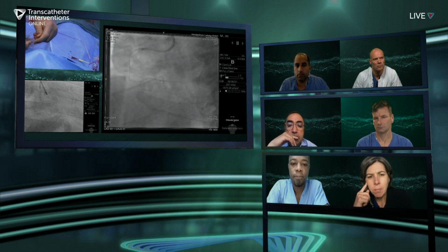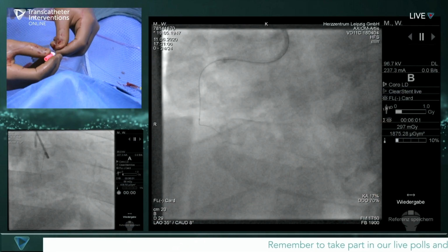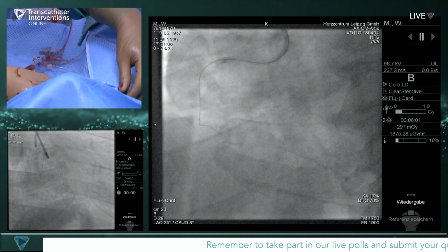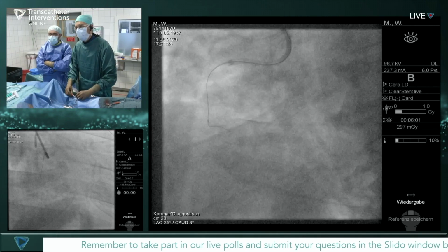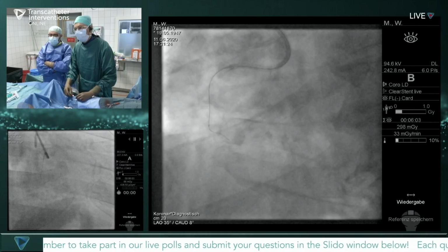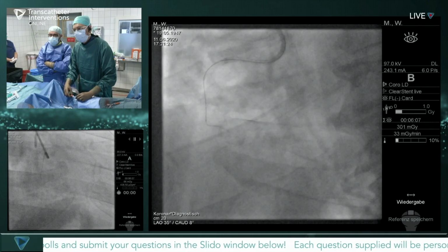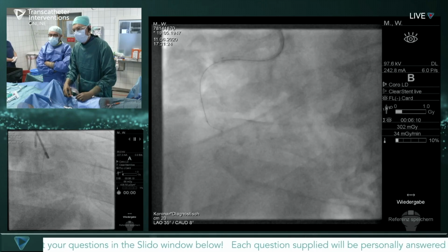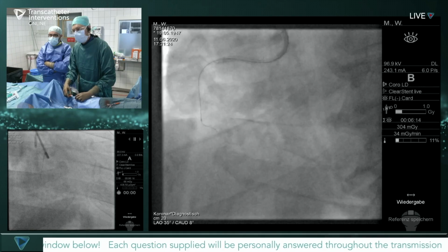Yeah, I think you're totally right. Maybe we're a bit overconfident here that we will manage antegradely, particularly given that we got the task to do an antegrade case. But you're totally correct. Having a 7 French catheter for the retrograde approach would also have many advantages, of course.